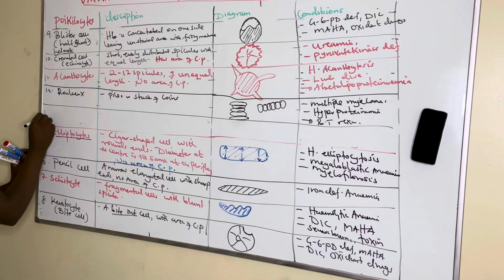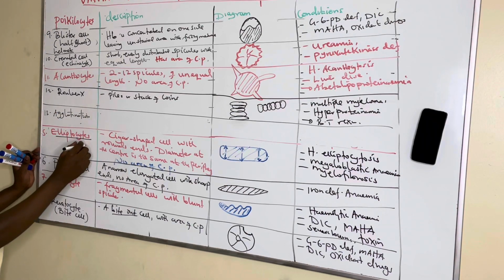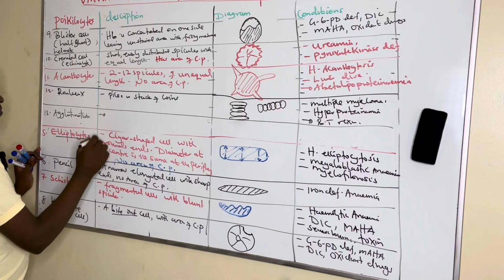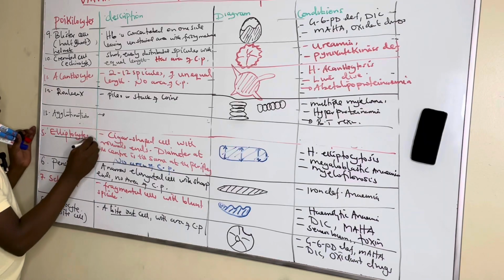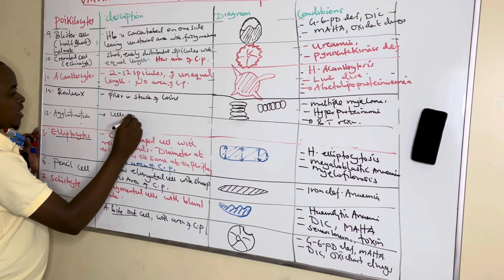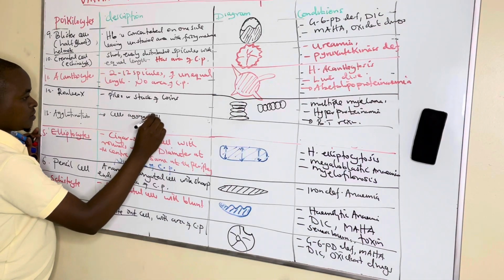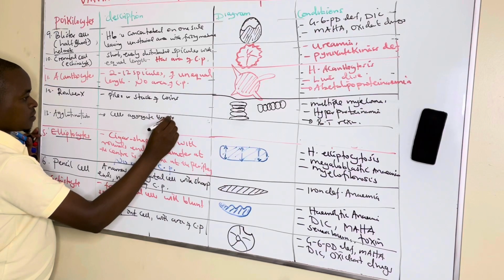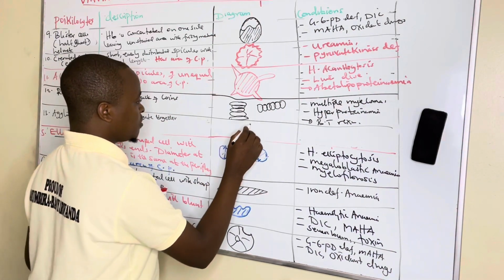And there is another one known as agglutination. In agglutination, the cells join together completely. Different cells aggregate together, so you cannot distinguish which one is a cell and which is not a cell.